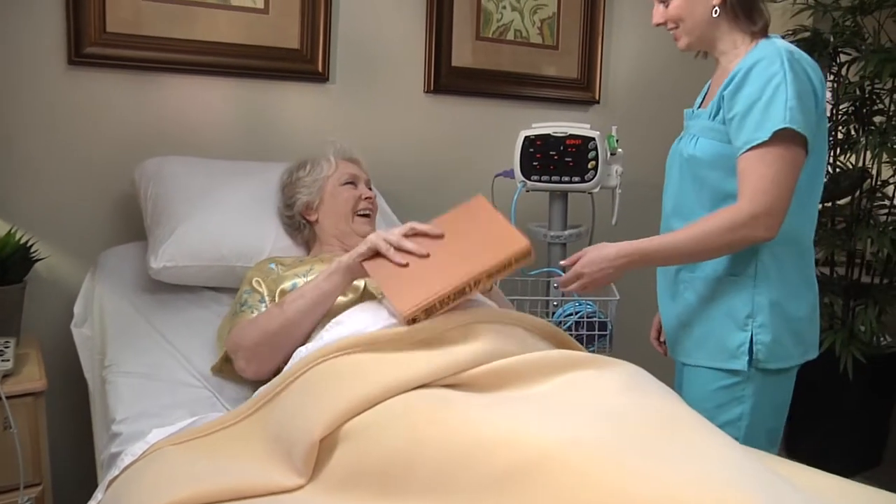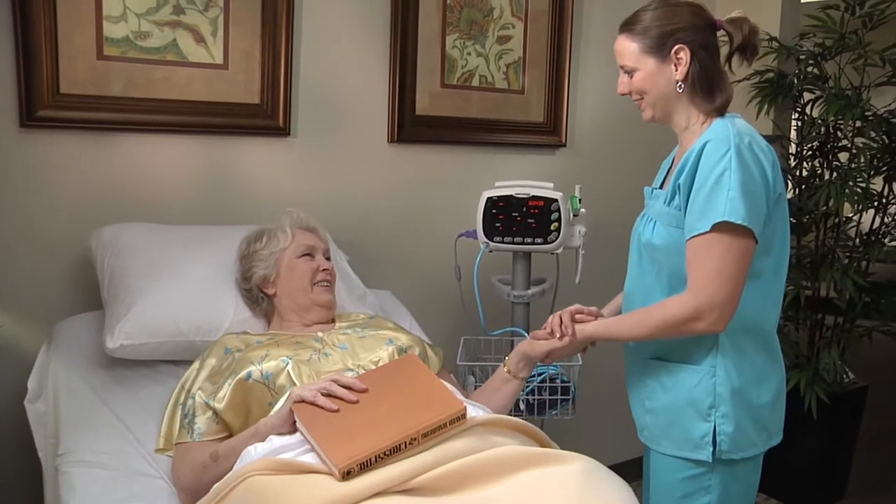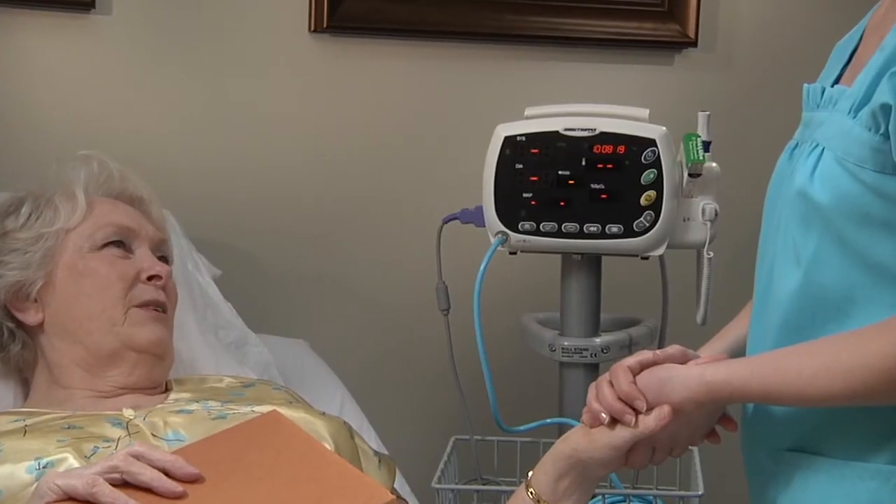Welcome to the instructional video for taking pulse oximetry and pulse rate measurements with the Direct Supply Attendant Vital Signs Monitor.